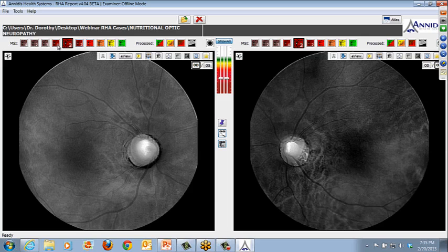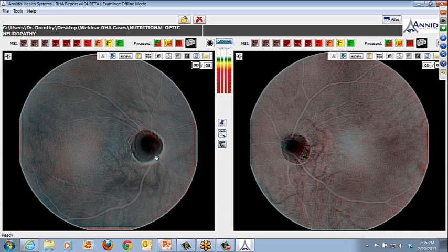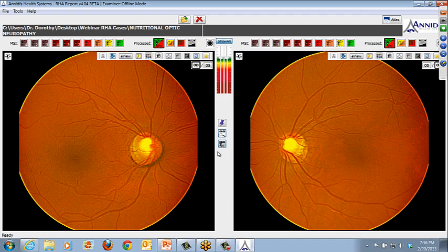I took a look at her retina, and I certainly saw significant peripapillary atrophy, as can be seen here in the reds, and certainly significantly here. There's certainly some asymmetry to the disc, but these are slightly different angled images here. If you look at the stereo map, there's certainly some central atrophy and deepening of the cup here. But of most interest here, so you're thinking, okay, does this patient have glaucoma? She's young. She had no other secondary findings, normal IOP, certainly not a vascular path, no family history.